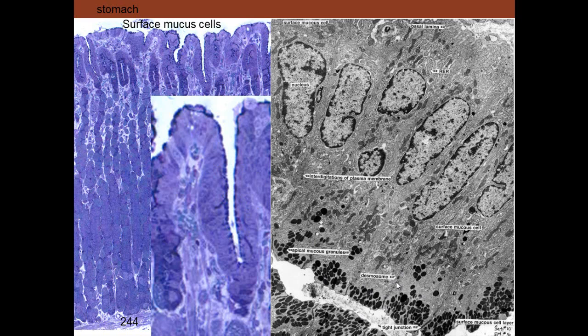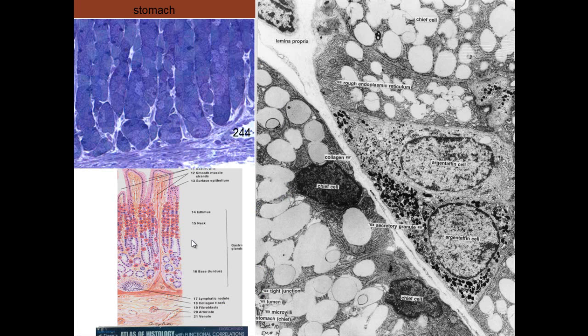Of course, you will still have tight junctions between adjacent cells to be able to make a lumen of the epithelial cells, and the lamina propria is down below there. We can see some smooth muscle cells there and some other nucleated cells, as we'll see in more detail in a minute.